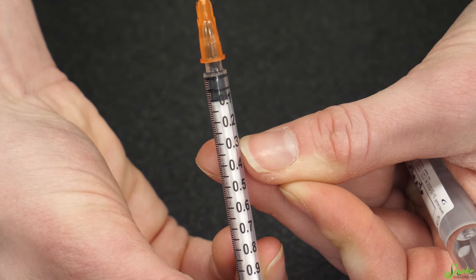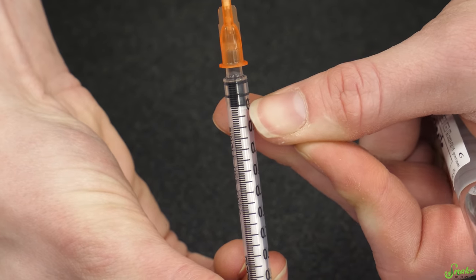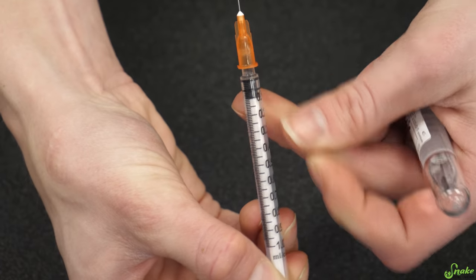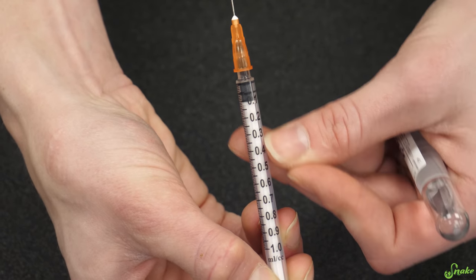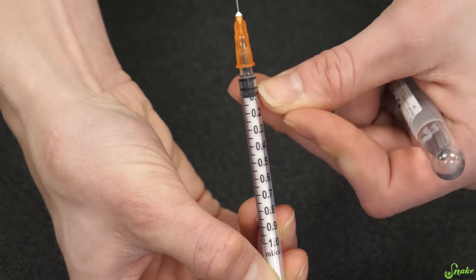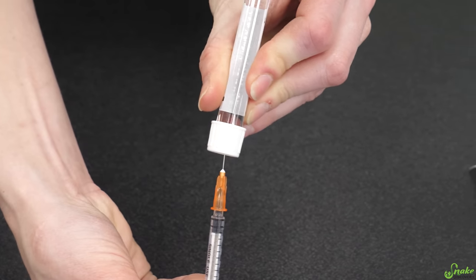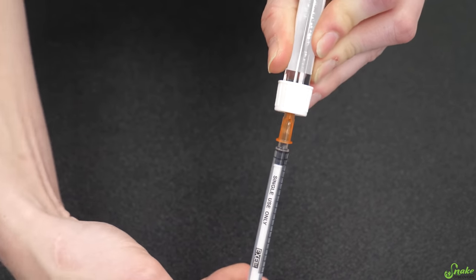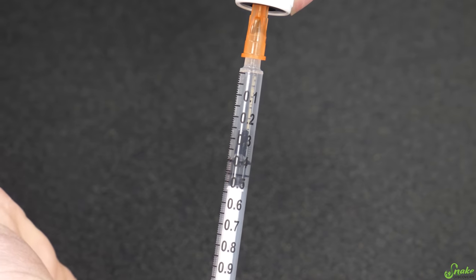However, if it calls for 0.03, which is pretty common to need a very small amount, that means you only need that much. So if you mix it up and you need 0.03 but misread it as 0.3, you're going to give your reptile 10 times the dose that they need. So again, closely read the prescription and how much you need. Needle side up, we're going to insert it into the vial, and then pull back on the plunger, and that'll create a vacuum which will pull out your medication.